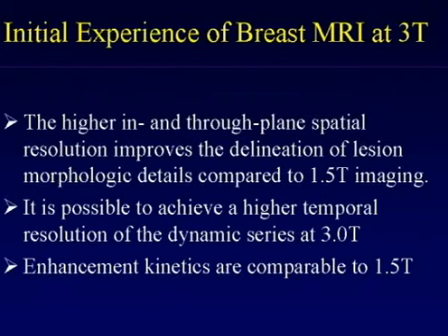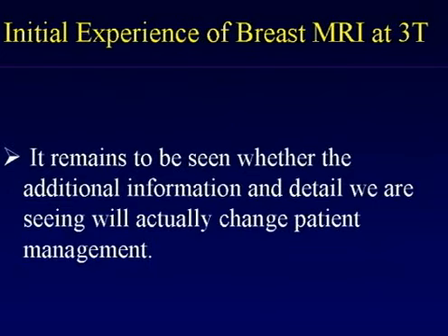In addition, as I mentioned, we are trying to figure out various ways of manipulating the possible temporal information you can get at scanning at a high field magnet. But to date, the only thing that I can say is that these enhancement kinetic curves that we're obtaining at the 3T is comparable to that at the 1.5T. And as I showed you from the other slide earlier, it really remains to be seen that even though you're seeing additional information and detail, at the end of the day, is it really going to change the patient's management? I'm not sure about that at this point.